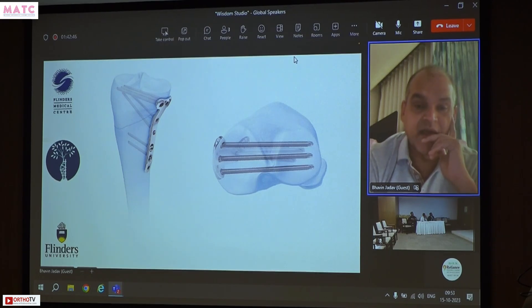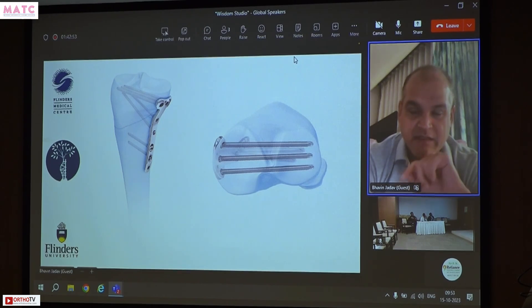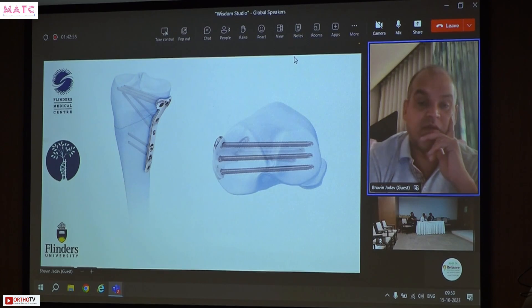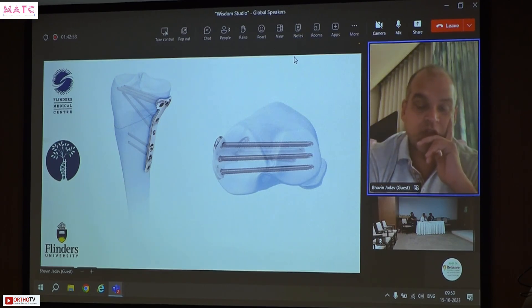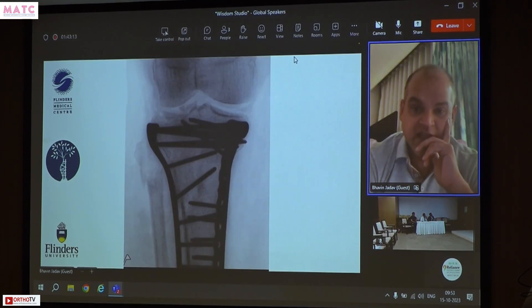When there is a metaphyseal dissociation, the medial plates are the ones to use — the medial column plate sits directly on the medial side. If you place this plate posteriorly it won't fit; similarly, putting the posteromedial plate on the medial or intermedial side will cause problems, because these are anatomic plates and you cannot put them in a place where they're not meant to be. This case required a direct medial plate and a lateral plate to get column and height references right.